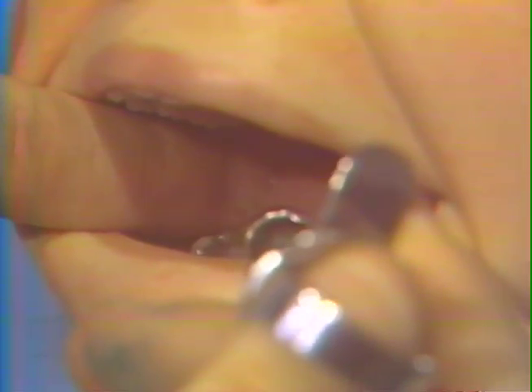The ridge to the medial side of the coronoid notch is the internal oblique ridge and is a very important landmark for this injection. Palpate the internal oblique ridge. The approach of the needle is opposite the bicuspid teeth on the opposite side, with the first point of reference being the internal oblique ridge.